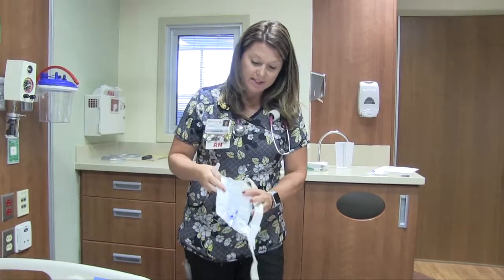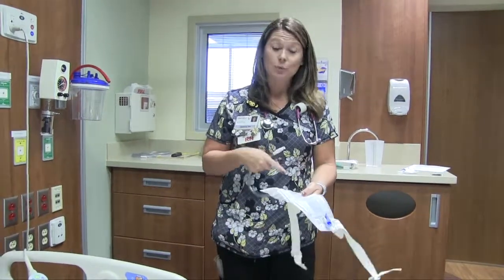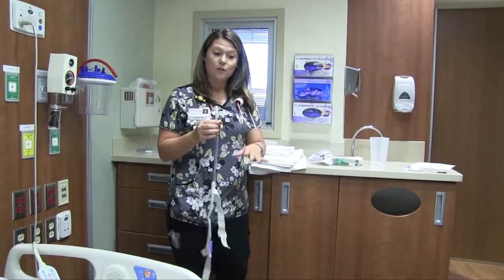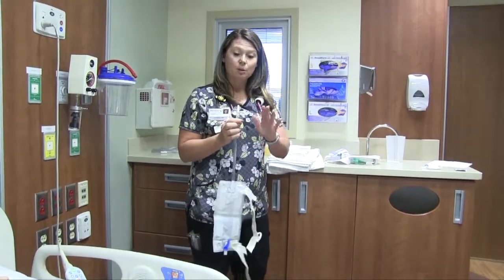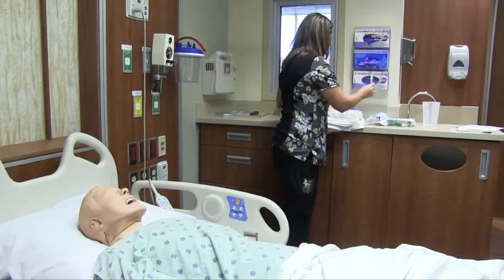The other thing with this system is it has different leg straps, and once I hook it onto you, I will show you how to actually use these straps, okay? So we need to actually get a few things ready while we change over the catheter, and this is something that you guys are going to do at home. Anytime you're going to mess with your catheter, you need to wash and dry your hands with soap and water, okay? So we're going to do that.